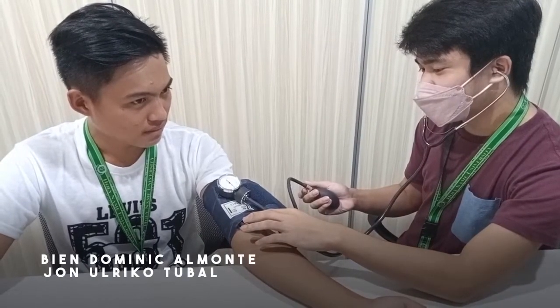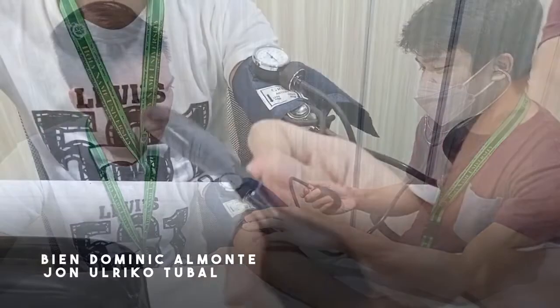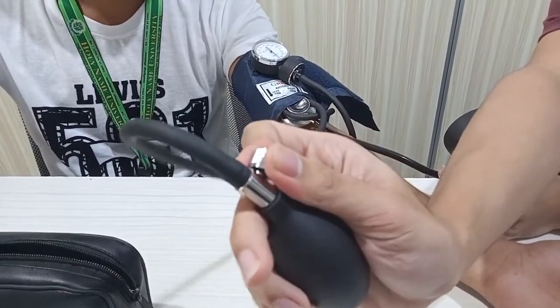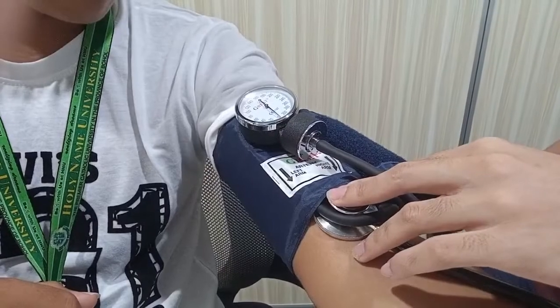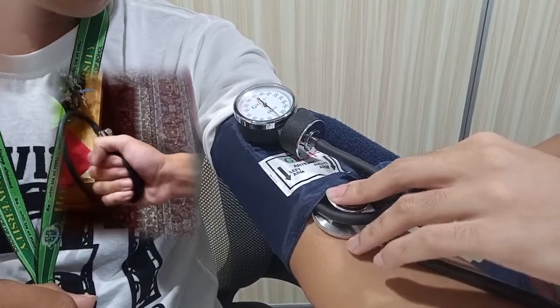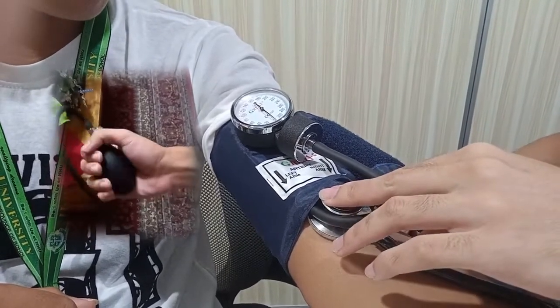First, hold the pressure gauge in your left hand and the bulb in your right hand. Second, close the airflow valve of the bulb by turning the screw clockwise. Third, inflate the cuff by squeezing the bulb with your right hand. You may hear your pulse in the stethoscope.